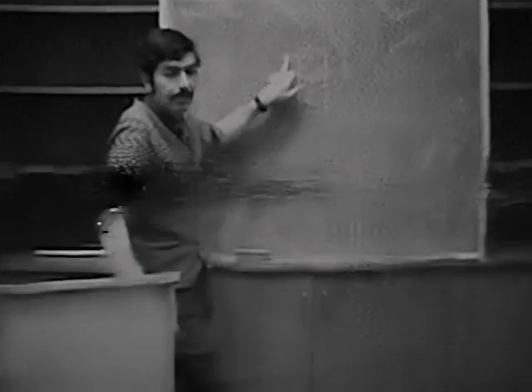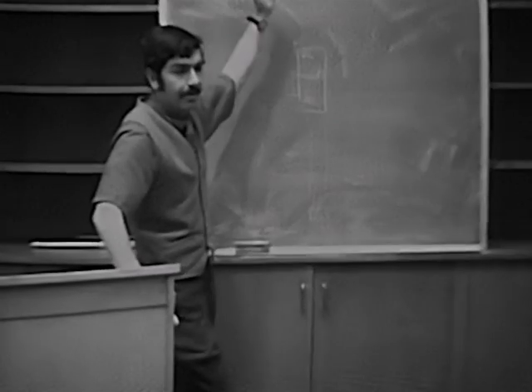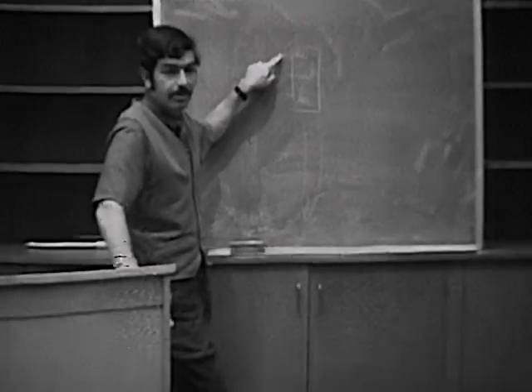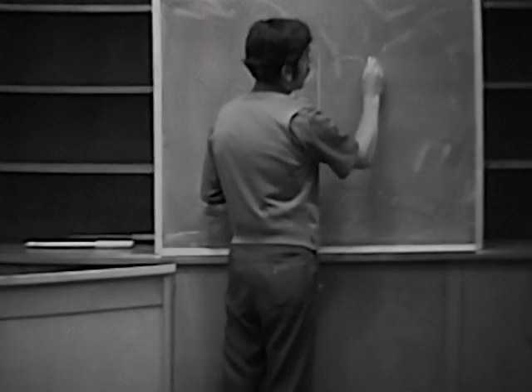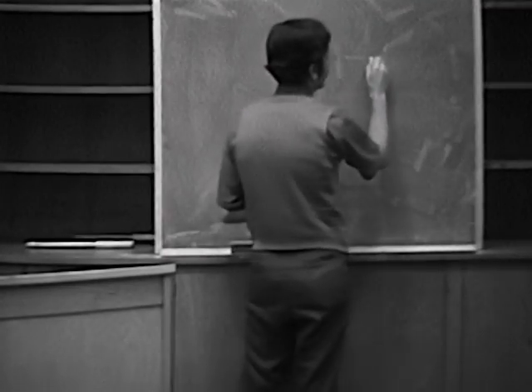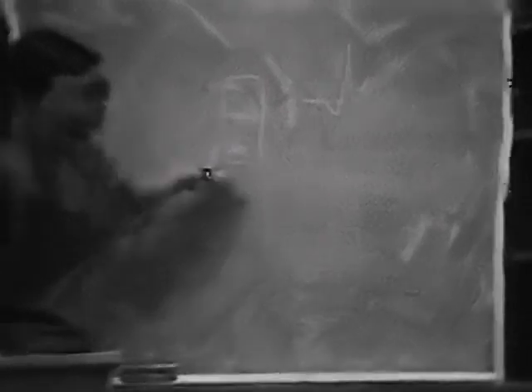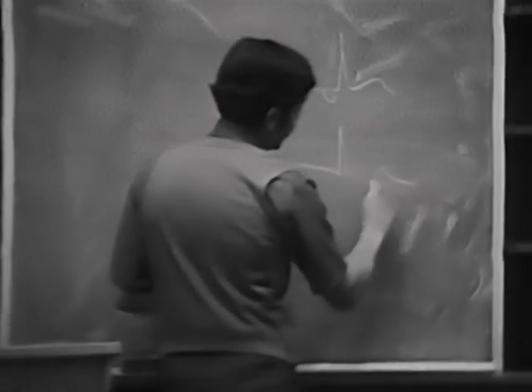Now, if they were to arise from high in the node, and this were a race, let's say it's like a race. They start here, and they're heading down and up at the same time. The high node, where's it going to get to first? It's going to get up first, right? So we're going to wind up with a P wave, which is inverted, right? But it's going to be located before the QRS. Whereas if we have a low nodal rhythm, where's it going to get to first? It's going to get down first, right? So what we're going to see is the P wave following the QRS.